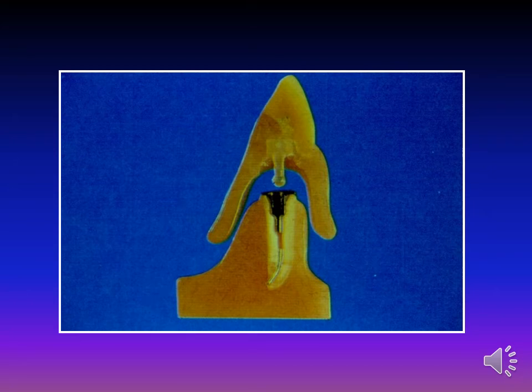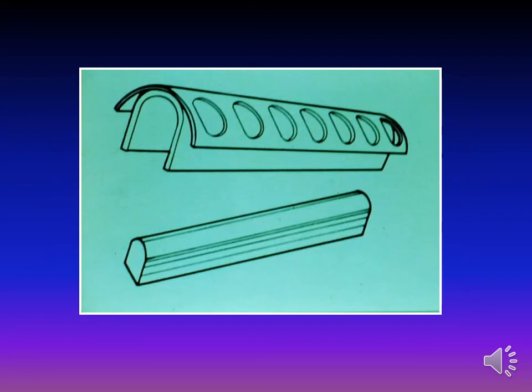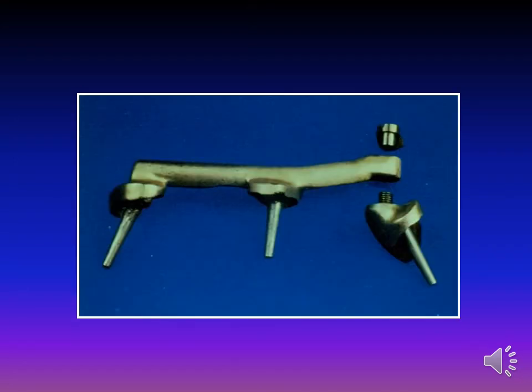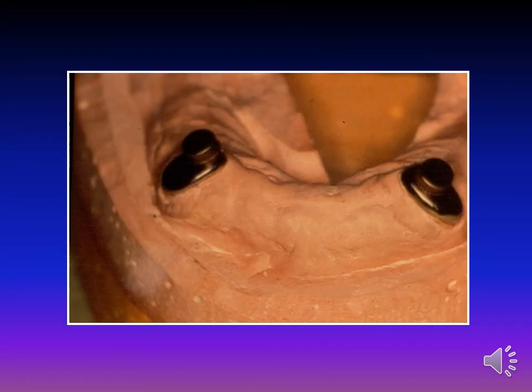This is a stud attachment, a bar with stud attachment, and a bar with Schubiger attachment, which is used with non-parallel abutments, like this. This is magnet attachment.